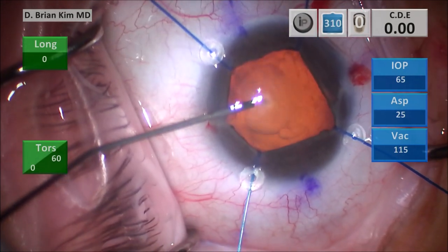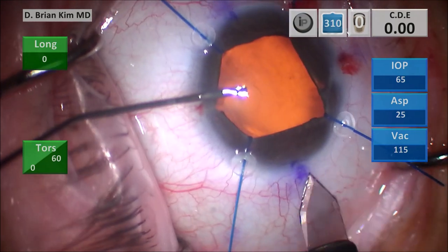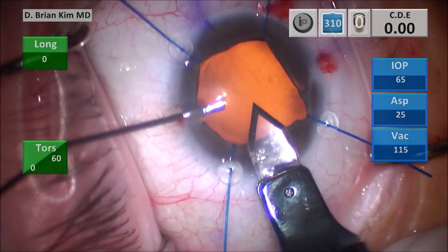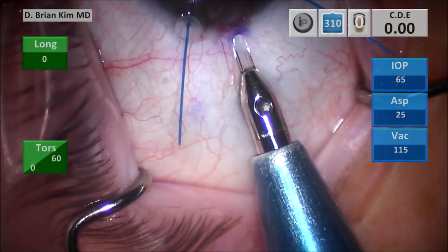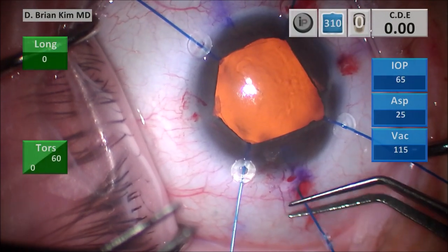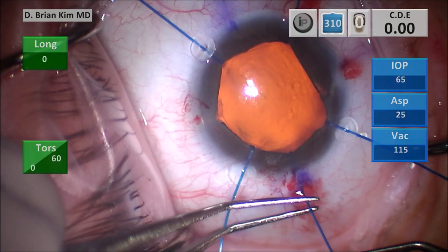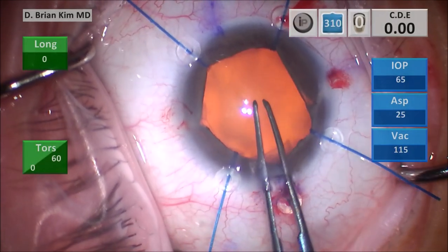I'm injecting dispersive viscoelastic and then doing my triplanar corneal incision — making a vertical groove, placing the blade into the groove, tunneling through the cornea, and then diving down. I make a paracentesis underneath my main incision through the sclera and then place another iris hook here, because in cases of potential iris prolapse I like to support the iris at the level of the incision so that it does not prolapse into my incision.